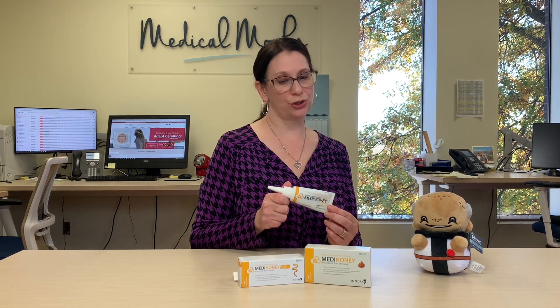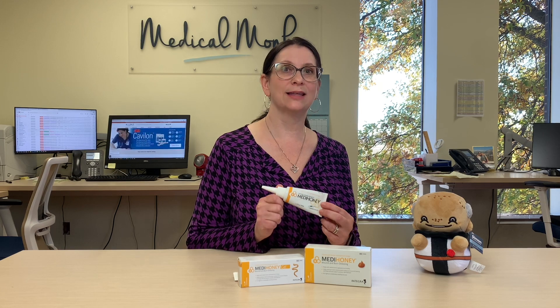It doesn't say that it is ingestible. It's non-toxic so it won't hurt you. So let's look at a demonstration of the difference between the paste and the gel.